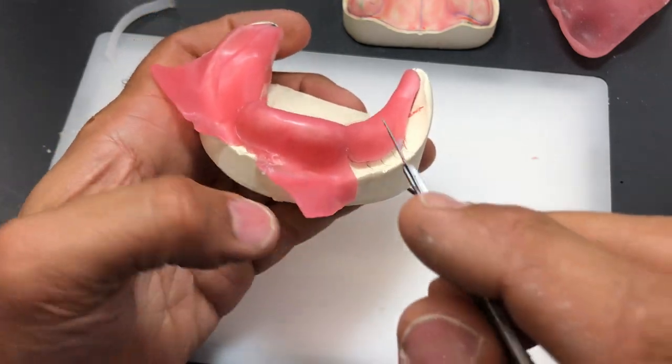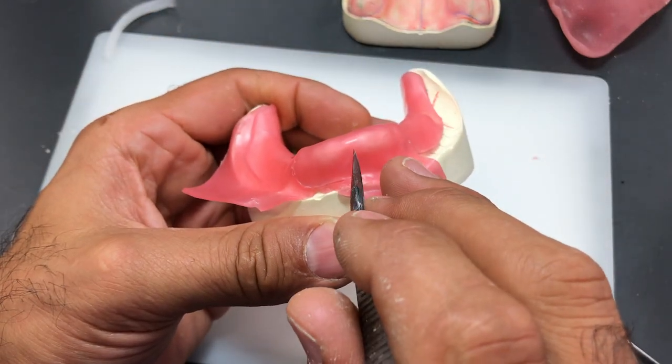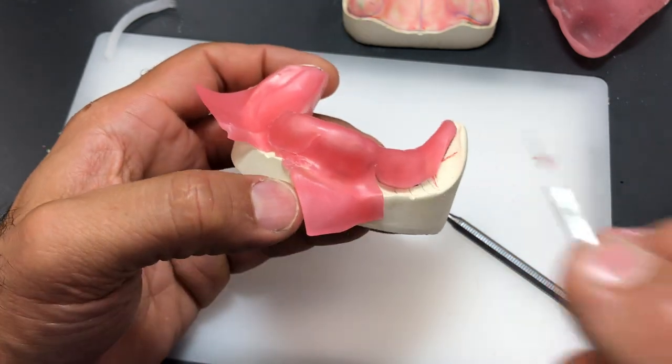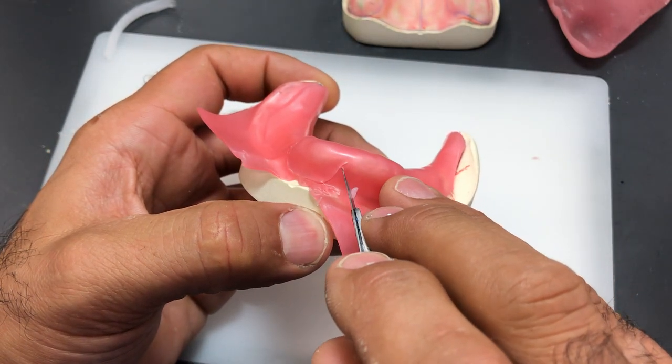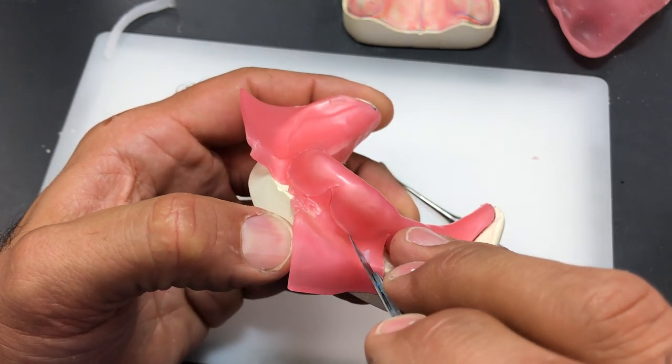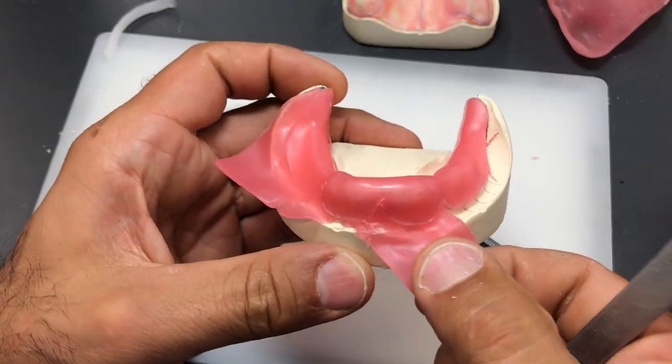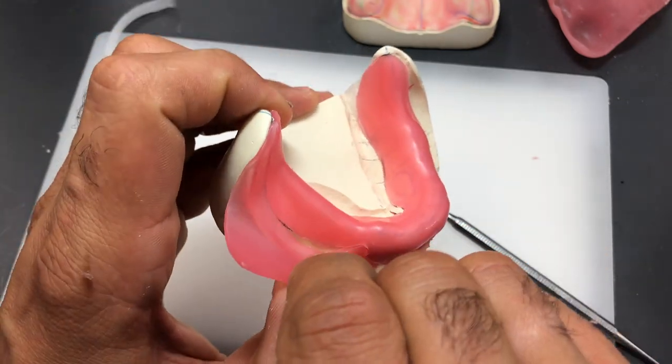Now, it's a little difficult to see through all this block out here at the interior portion, but I have a pretty good idea where the outline was, and I can vaguely see it through. So I don't think I'm that far off.